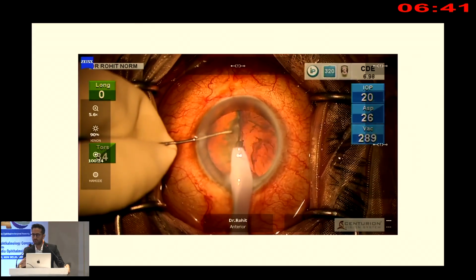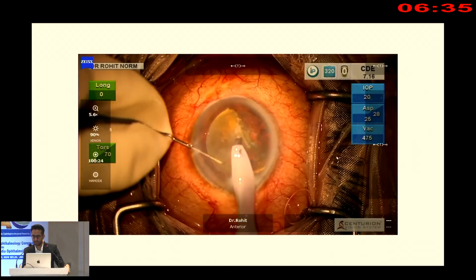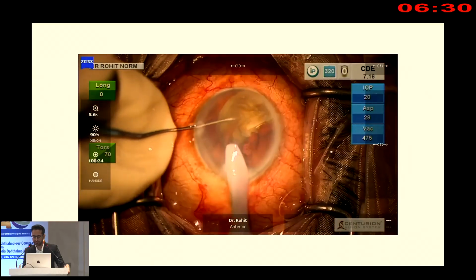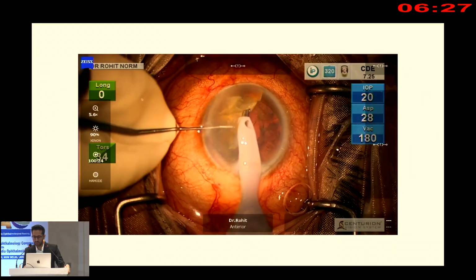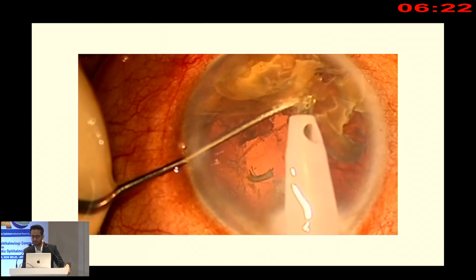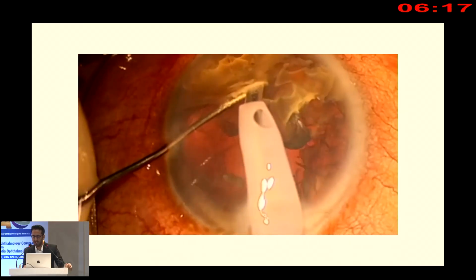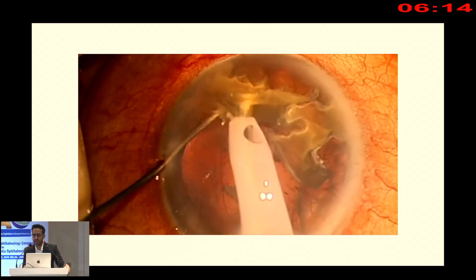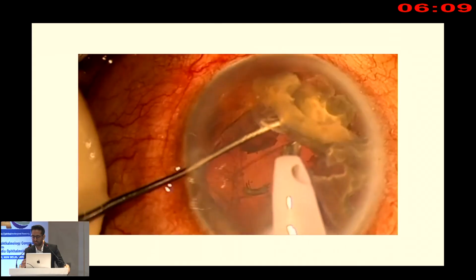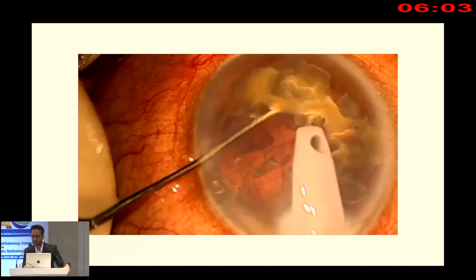There is no undue deepening of the anterior chamber, no posterior bulging of the posterior capsular defect. The remaining hemisphere is brought into the anterior chamber, and it is slowly aspirated. I would like you to focus on those three small nuclear pieces which are lying over the hyaloid face. Minimal turbulence and low pressure fluidics prevent any disruption of the hyaloid face. So what I'm trying to do here is use the hyaloid face to my advantage, so that it is acting as a shield to these small nuclear fragments.